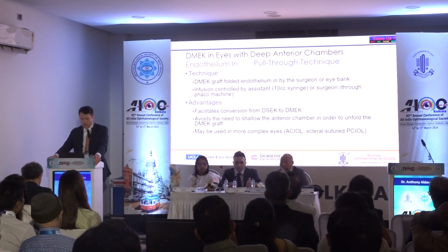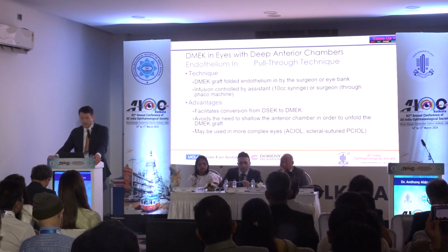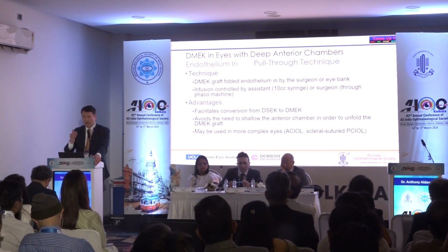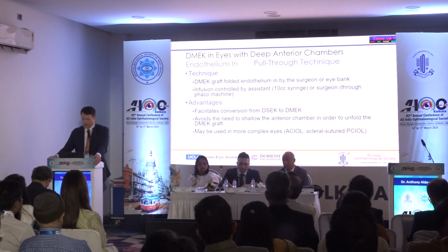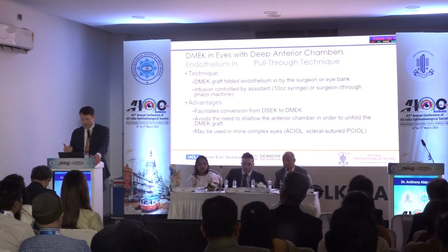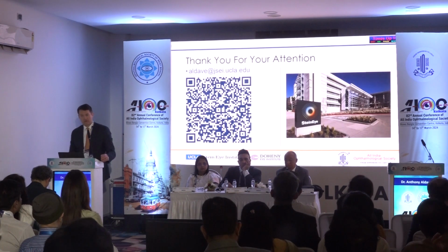So using this endo-in pull-through technique, the DMEK graft is folded by the surgeon or by the eye bank. Infusion, again, is either controlled by an assistant or the surgeon. It's a really helpful technique to transition your trainees from DSEK to DMEK. It also avoids the need to shallow the anterior chamber to unfold the graft, and makes it possible to do DMEK in eyes with ACIOLs or scleral-fixated PCIOLs. Thank you very much for your attention.